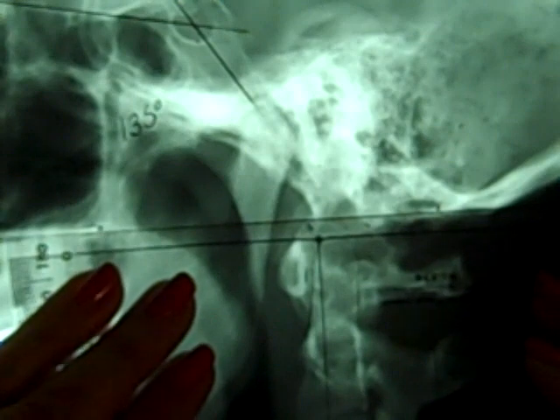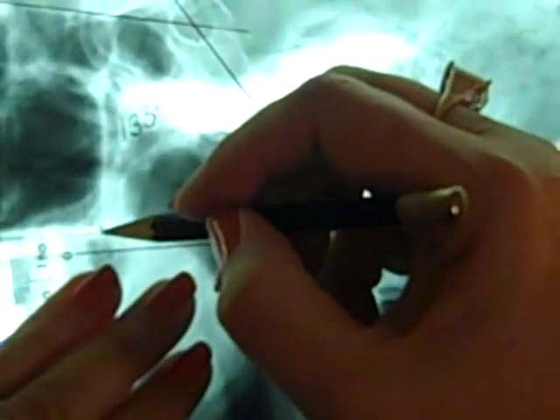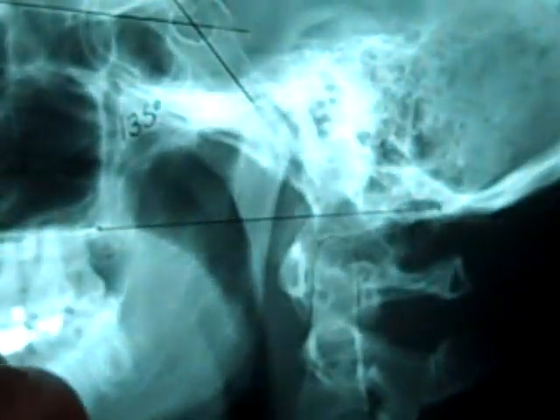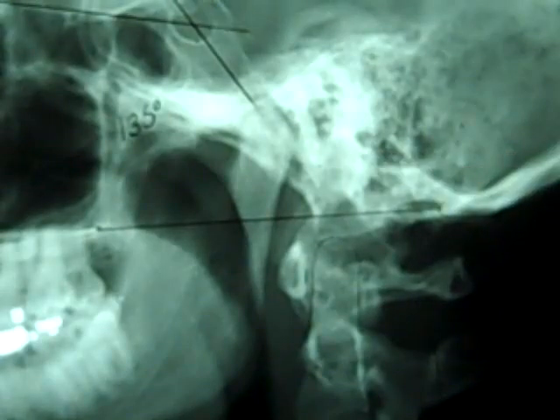You draw a line using those 2 points, and again you're looking to see, is the odontoid above the line? Well, I've drawn in the odontoid process, so you see in this case it's not any above the line, so nothing to worry about. But if it were abnormal, we would not want the dens to be more than 3 millimeters. We do not want to see more than 3 millimeters of the dens above the line. If you do see more than 3 for Chamberlain's, you need to be worried about platybasia and/or basilar impression.